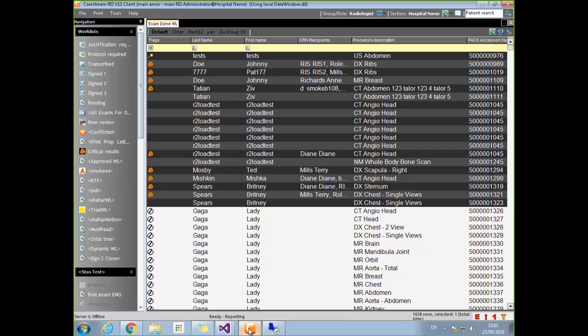Maybe we should have another option of a high importance list of people in the chat itself. If not, we'll see the name. Or maybe level by the lowest. If you are allowed to see these VIPs, you can open a chat with the participants. If they're not allowed to see it, really they shouldn't even be able to see the ID information in the chat for that case. Yeah, very good point.